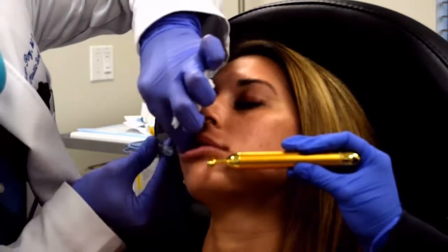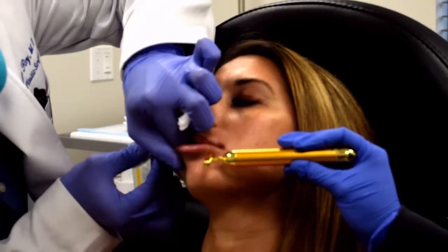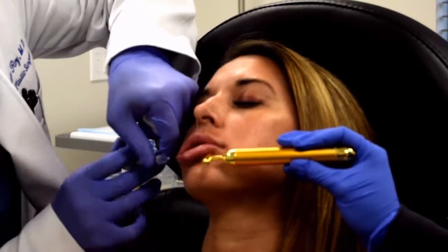You can also see that I use a vibration tool here to help with distraction, and it works really well. I also use it for my neuromodulator injections.